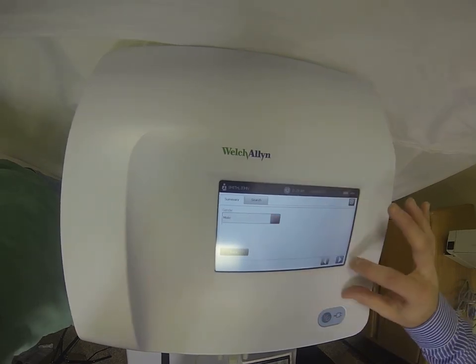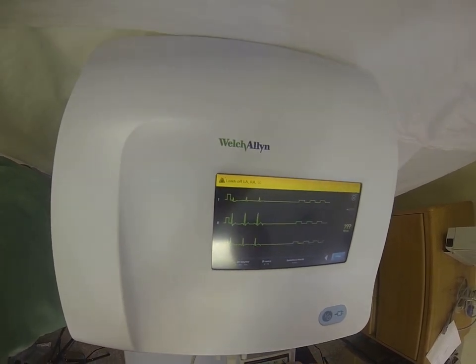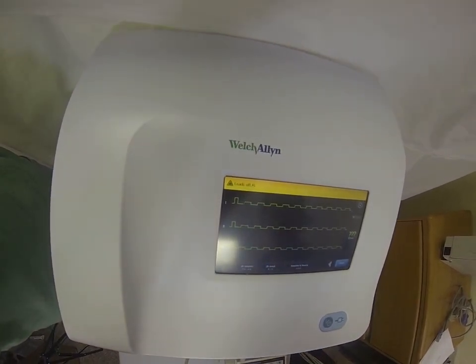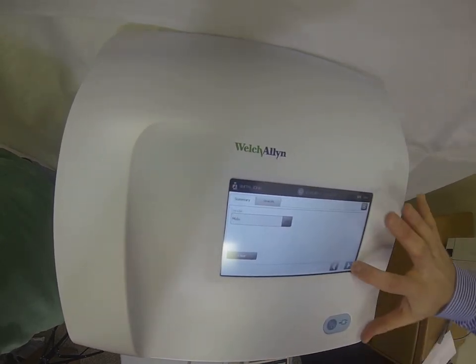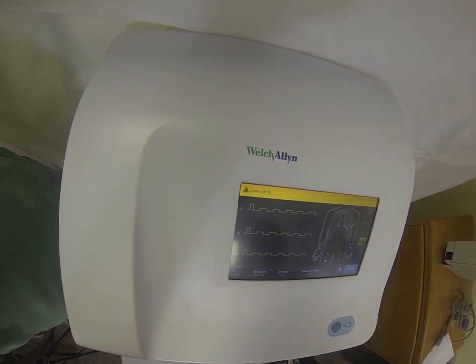Once the demographic information is entered, this will take you to your live lead preview screen. From here you're going to be looking at real-time data. One of the nice features about this machine is that it will actually walk you through the proper way to apply the leads to the patient.